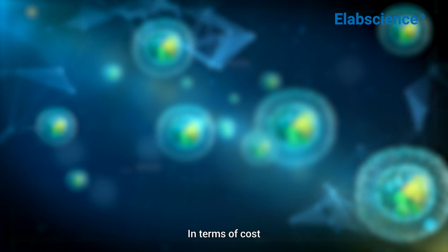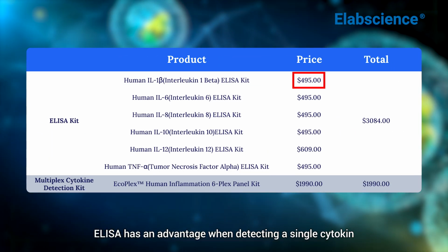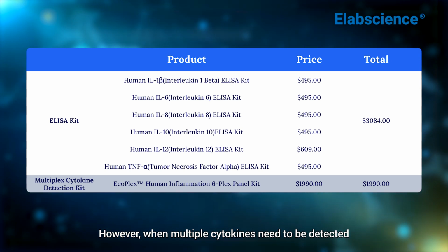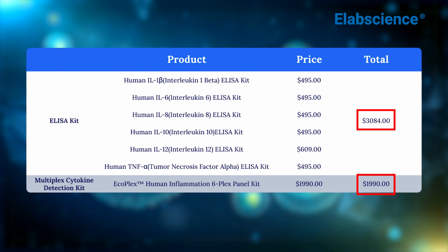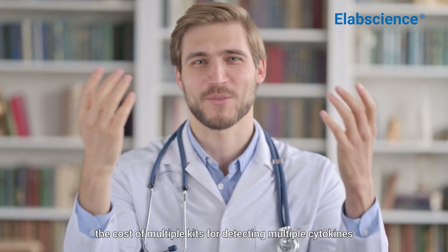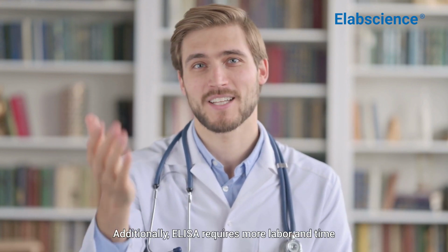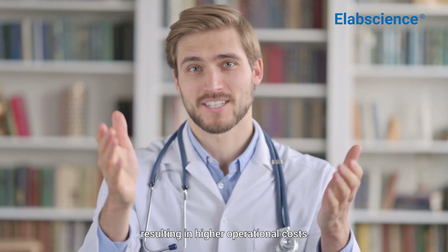Experimental cost. In terms of cost, ELISA has an advantage when detecting a single cytokine. However, when multiple cytokines need to be detected, the cost of a multiplex cytokine detection kit is significantly lower. From the overall comparison, it is clear that while ELISA kits are more affordable per test, the cost of multiple kits for detecting multiple cytokines can significantly increase. Additionally, ELISA requires more labor and time, resulting in higher operational costs.